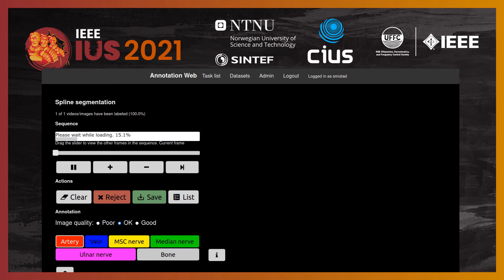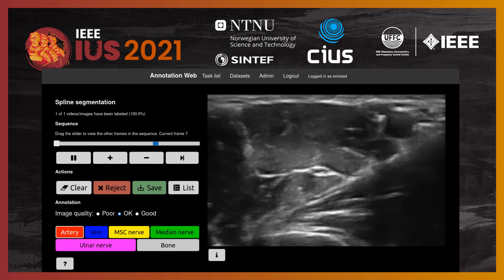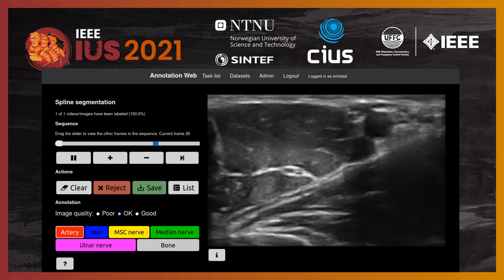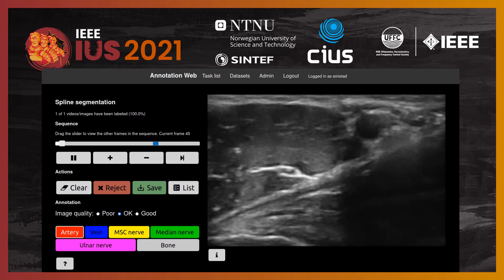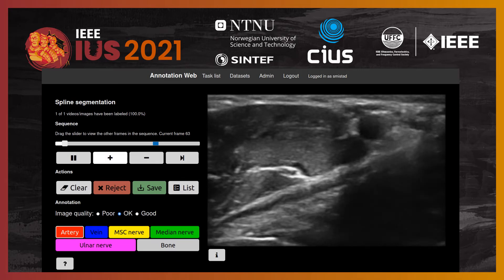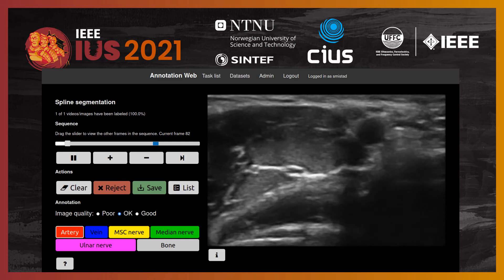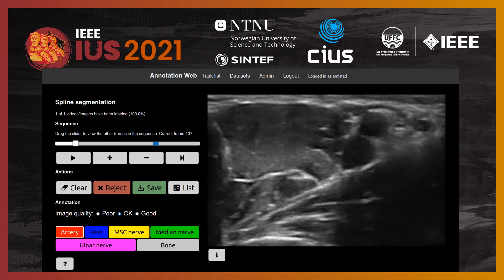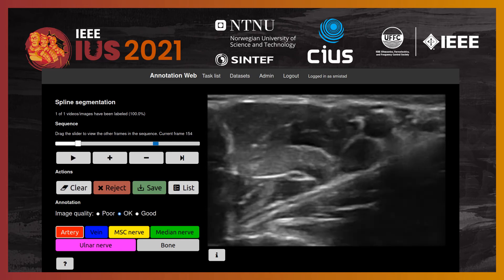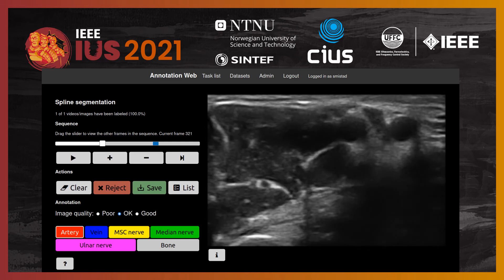Here you see the annotation tool. It starts by loading the ultrasound sequence, and once done, the ultrasound video will start playback. The user can easily scroll back and forth and select the frame to annotate.